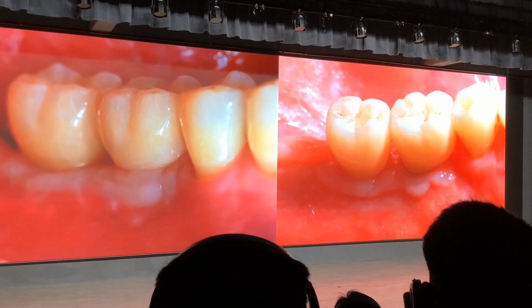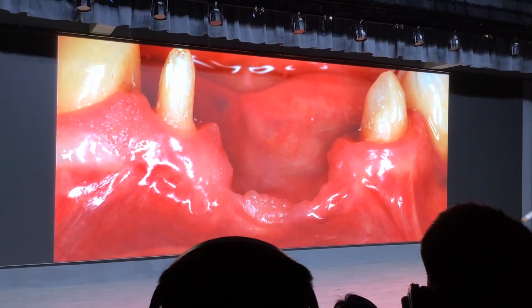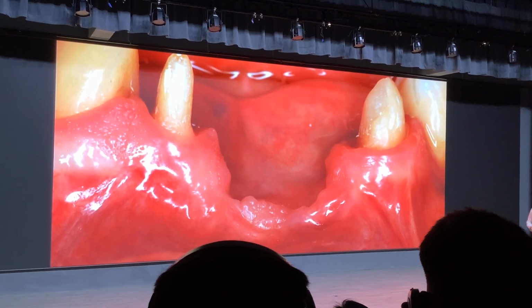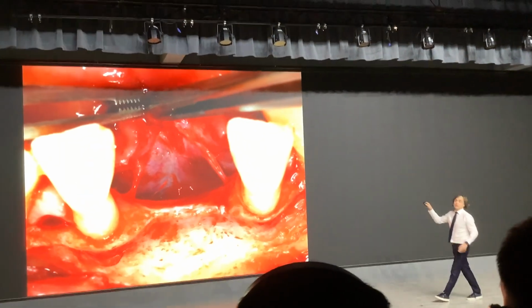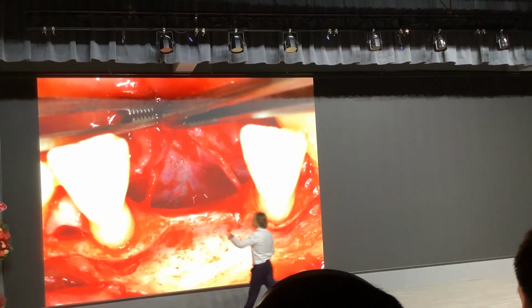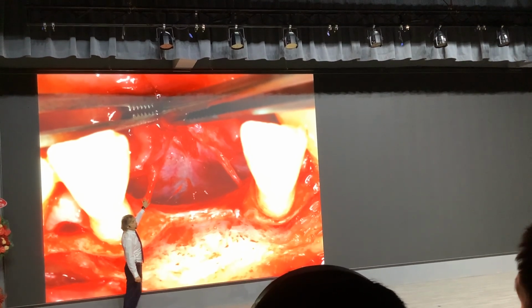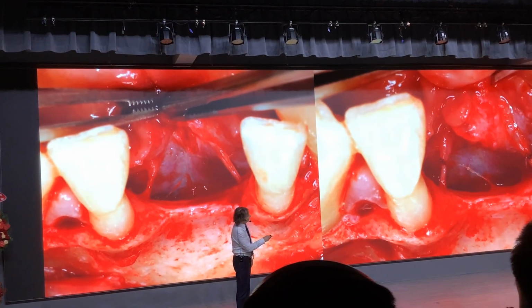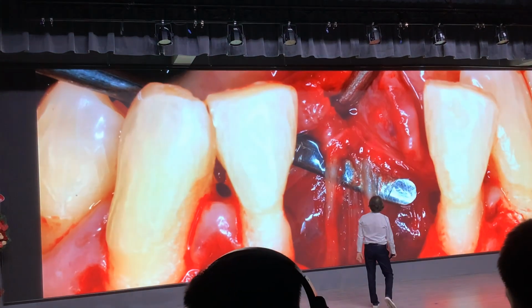Now, the anterior mandible. Okay, so we have quite a lot of patients coming like this. Previous implants failed and things like that. This patient has, remember the terminal branch, it is so small you can cut. But before you cut, put a suture. And cut here, don't cut here. Okay? You put a mini suture and then you can cut. But then you will have this.